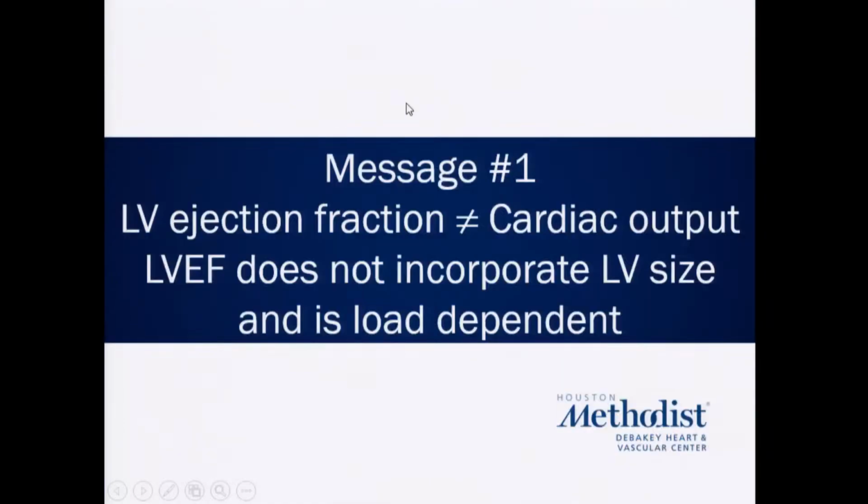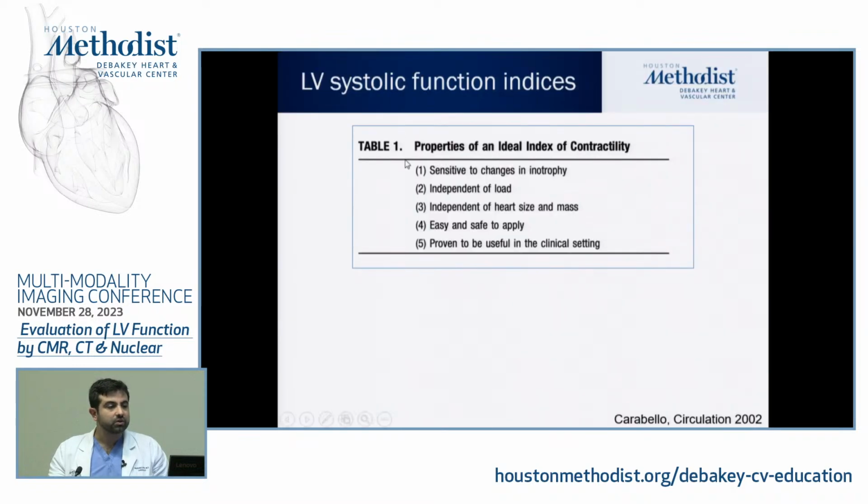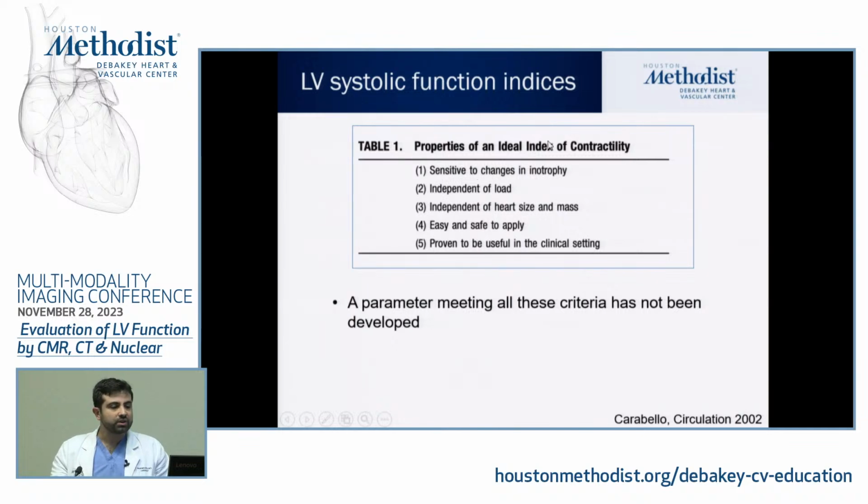So this is the first message, which is ejection fraction doesn't necessarily mean the cardiac output, and it doesn't really incorporate LV size, and is obviously very load dependent. The challenge is that meeting criteria for an ideal index of LV performance or systolic capability is difficult.